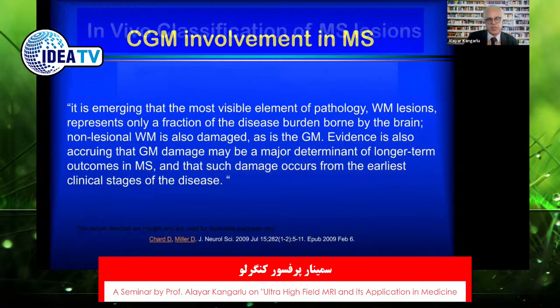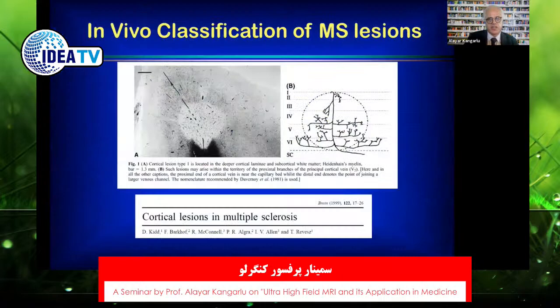We detected cortical gray matter lesions in multiple sclerosis. This is a paper that showed that in the samples of brain tissues, they had actually observed cortical gray matter demyelinations, and some of the difficulties in classifying MS with MR. People believe that lies in the fact that the cortical gray matters are invisible in MRI.